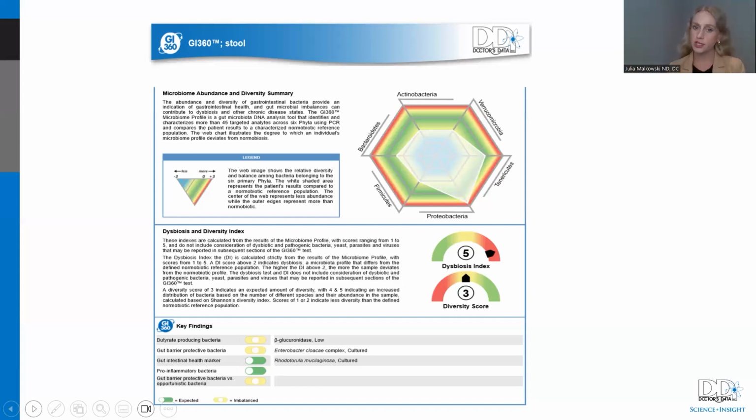The next piece of information we have is the diversity score. Diversity is a very interesting metric in that it is really foundational, and it is associated to not only microbiome and colonic health, but also systemic physiology, everything ranging from hypertension, cardiovascular implications, to extroverted behavior, anorexia nervosa.